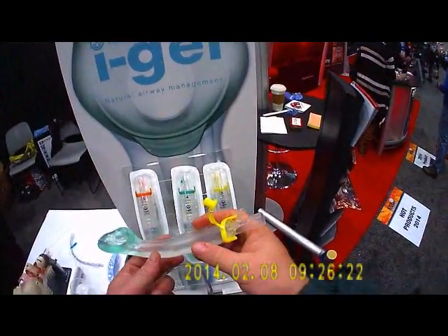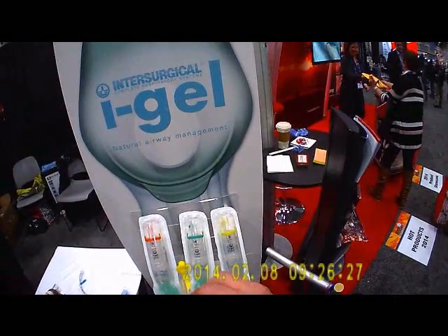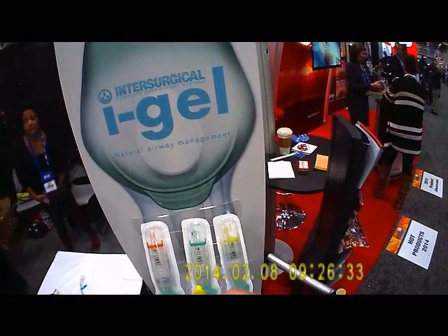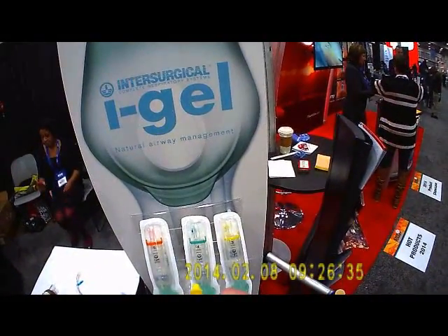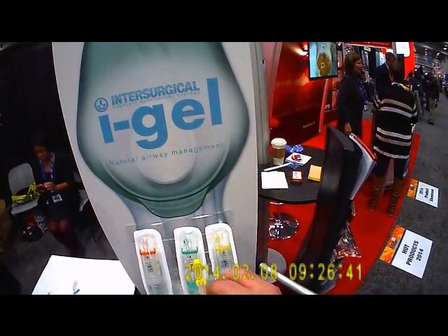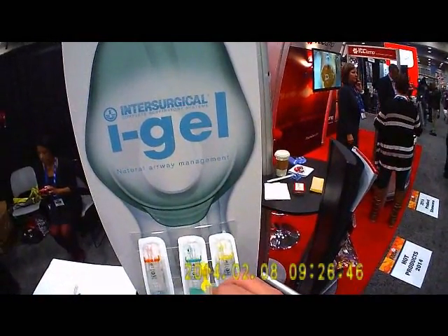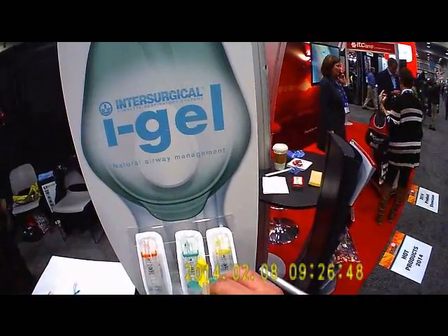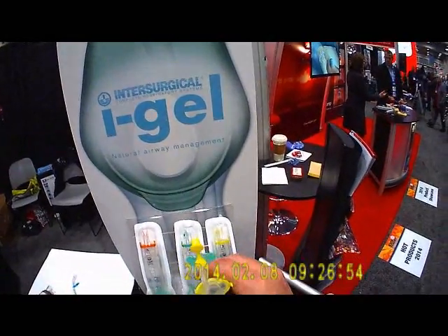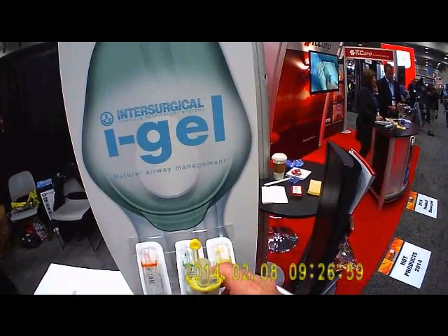With this iGel airway, we could drop an iGel rather than the OPA and non-rebreather mask, hook the iGel to 100% oxygen with a length of oxygen tubing, and passively oxygenate the patient far more efficiently. And when it comes time to transition, there's no laryngoscope to pull out, and you don't have to worry about the big pharyngeal balloon of a King or Combitube possibly occluding cerebral blood flow. You just slide an endotracheal tube through it, inflate the cuff, and you're good to go.